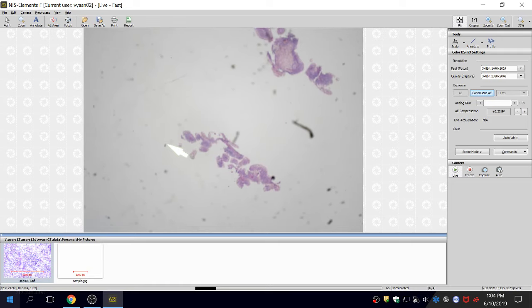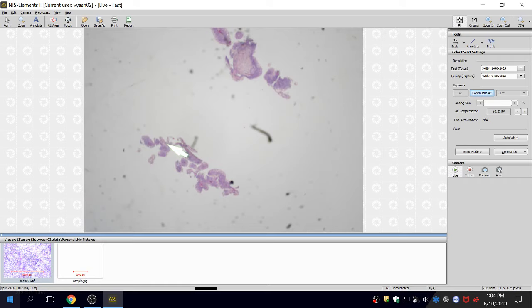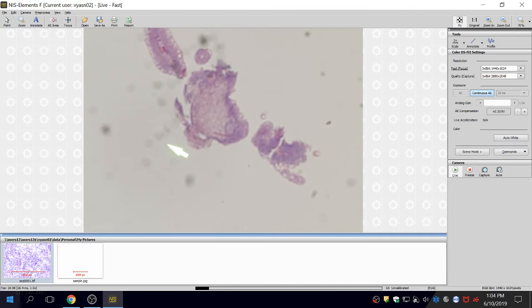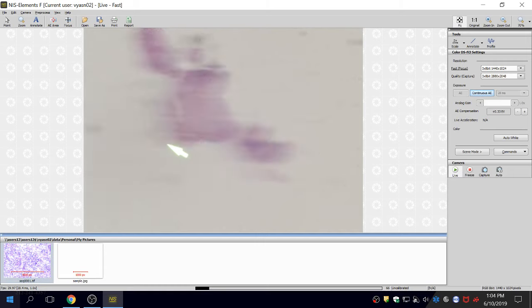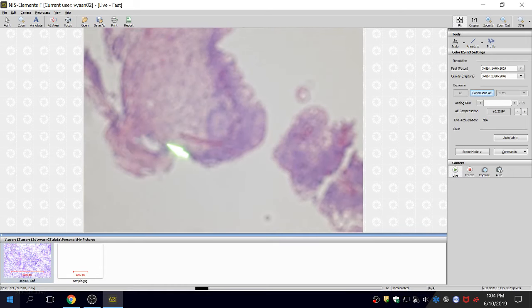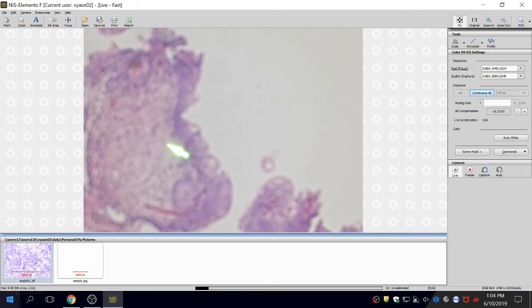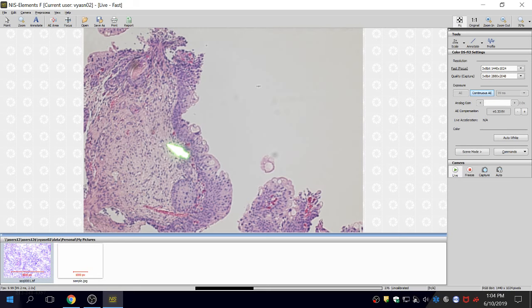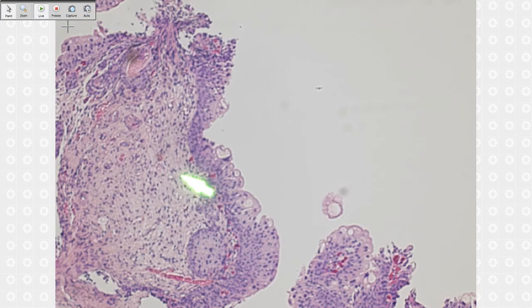I will try to focus on the screen first. Maybe 10x is easier to focus. Upside down, this is good focus. I'll go to 10x, it's easier. This one is better, right? Keep going, you should be able to see clearly. Better? Still bad? I think I have to focus on my microscope.